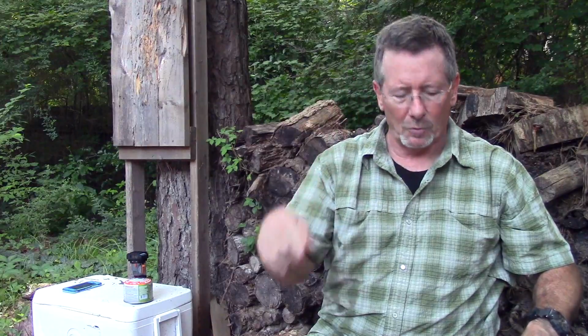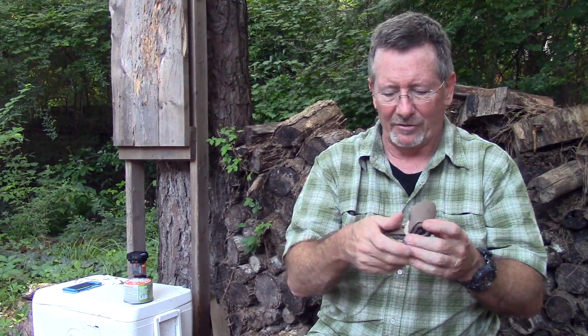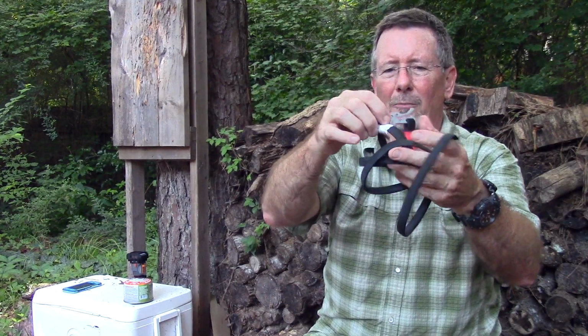You saw I had a little bit of trouble getting that hook situated right. This one gets a little smaller, a little easier, I think. And to me, it's easier to use one-handed. The pro of this one is that it's a lot easier to carry in your pocket if you fold it right. The RATS, because of the metal clip there, is a little more bulky.